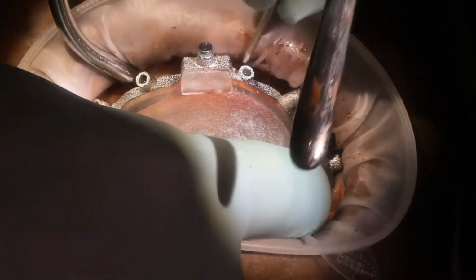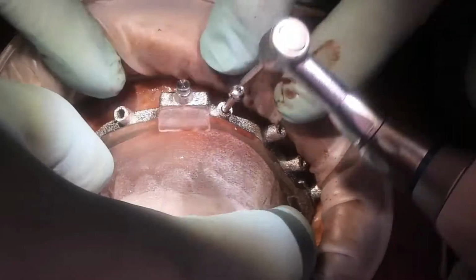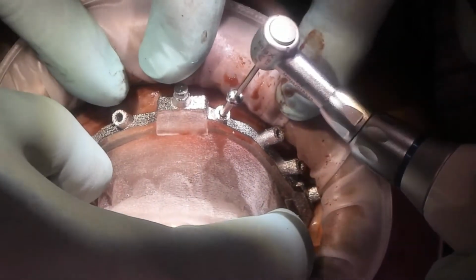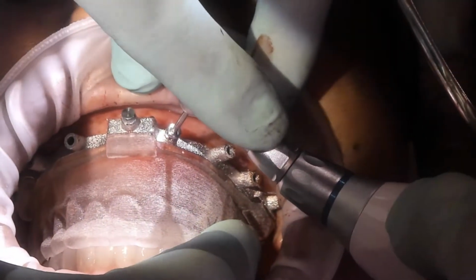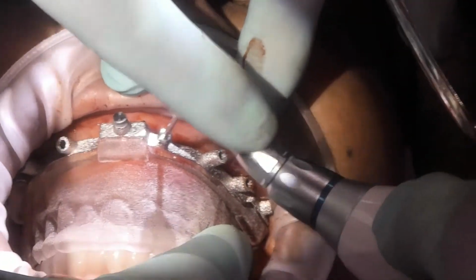Either option is acceptable. So again, just to reiterate, you can either place the pin guide, or in this case pin guides, initially and drill all of your sites, or you can lay the flap and allow the pin guide to rest just on the tissue on the ridge and the palate in the maxilla, and then drill the sites after the flap is laid. Either way is acceptable.